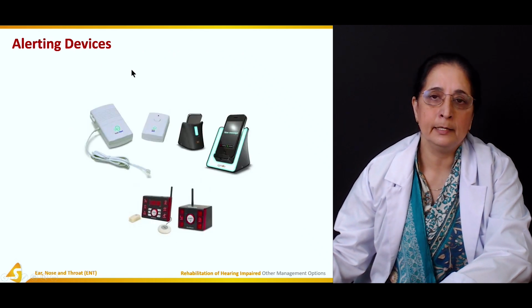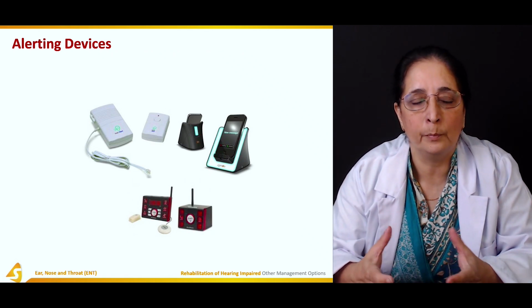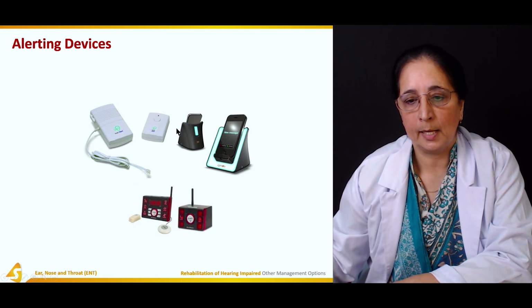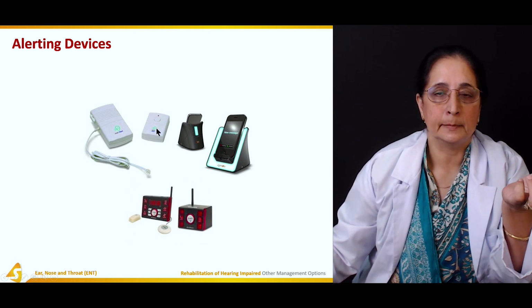Then alerting devices, like doorbells, flashing lights, and alarm systems.